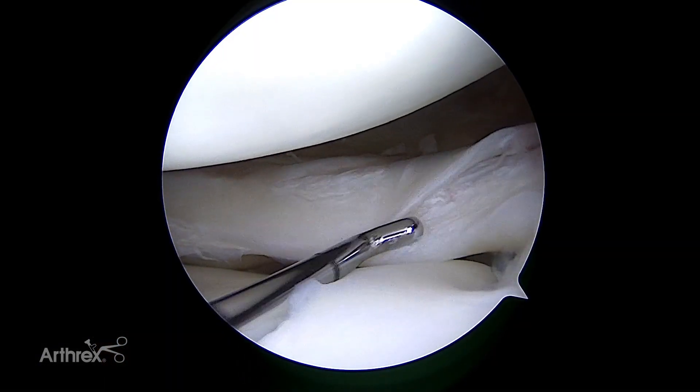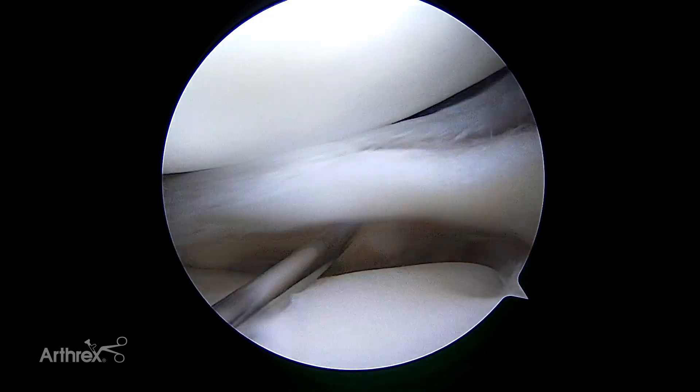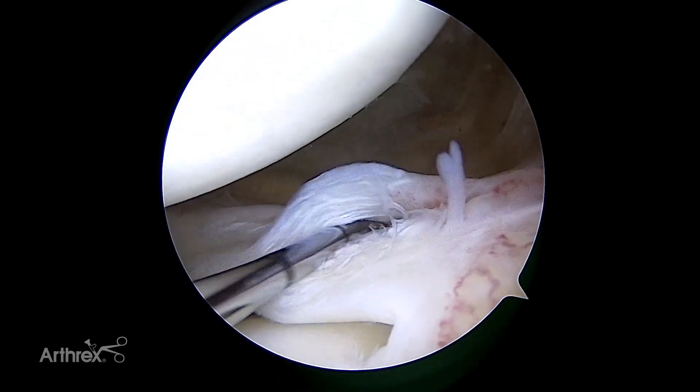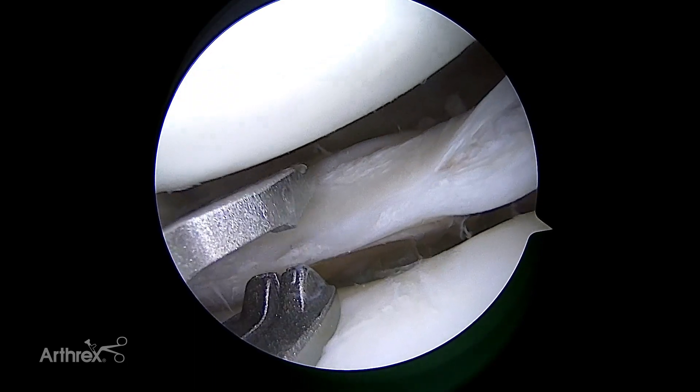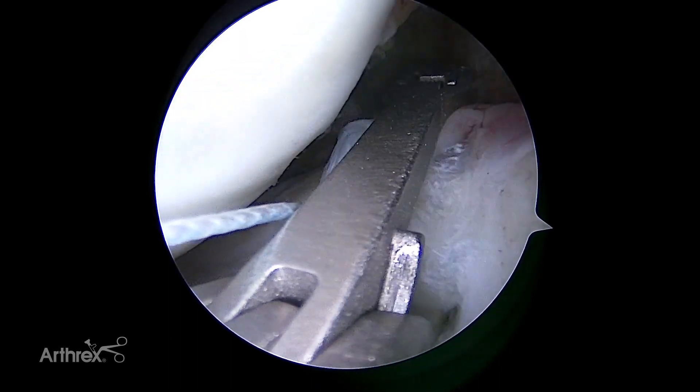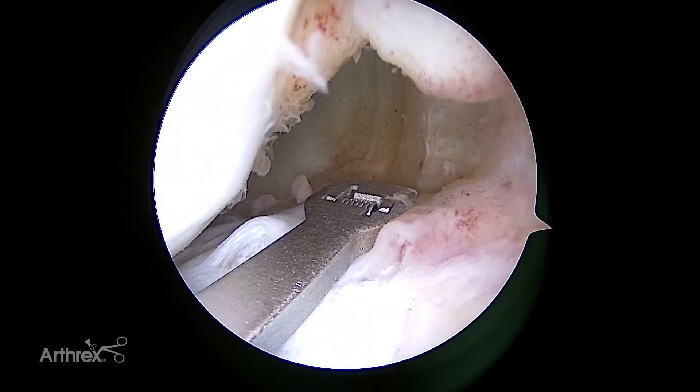This medial meniscus tear is a horizontal type and extends to the periphery, therefore it is a vascular type. The periphery of the meniscus is stable and we then proceed with the repair. The slightly up-curved jaw allows the device to easily pass over the meniscus. For vertical type suture configurations, it is recommended to place the posterior suture limb first.